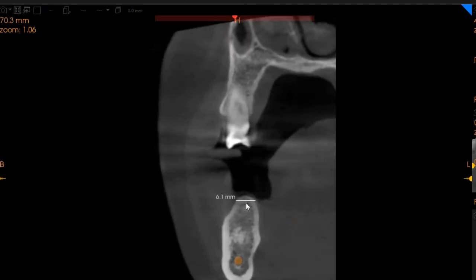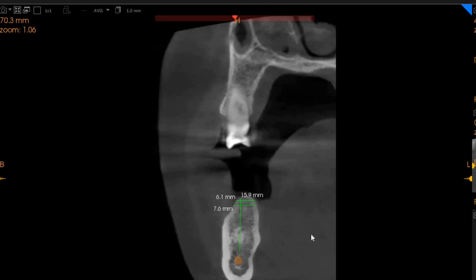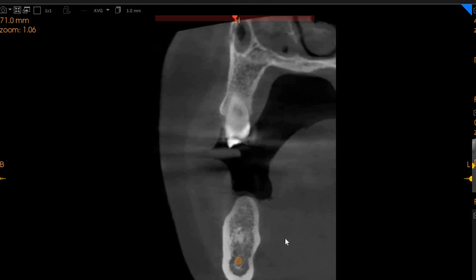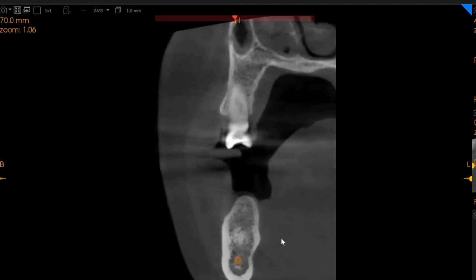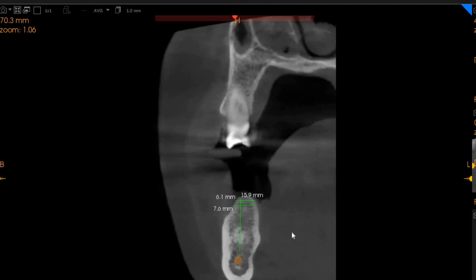In the region of the lower right six, we've got approximately good bone thickness — 6 millimeters of width with a good 16 millimeters of height. So even if a deeper implant is placed, we've got good 7.5 millimeters. D2 quality bone — there is a bit of osteodensification in this region, but other than that it should be insignificant; it could be a root piece or could just be an osteosclerotic event happening within the bone. Thank you very much.